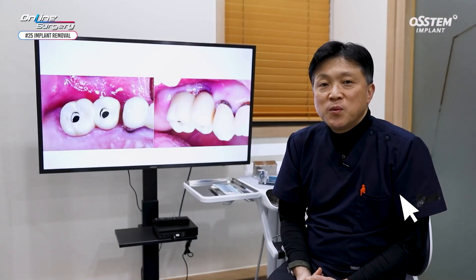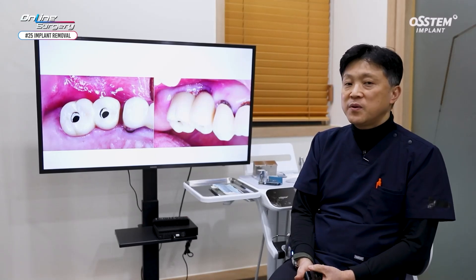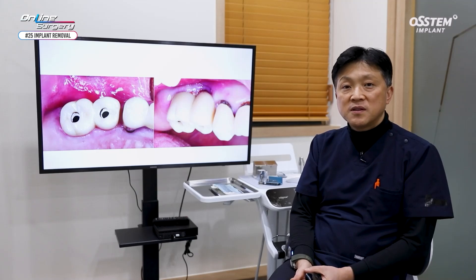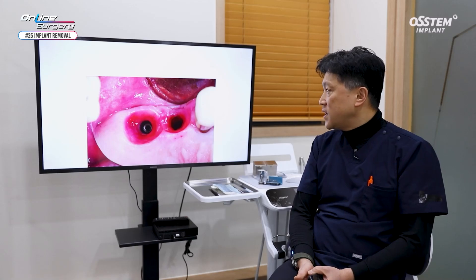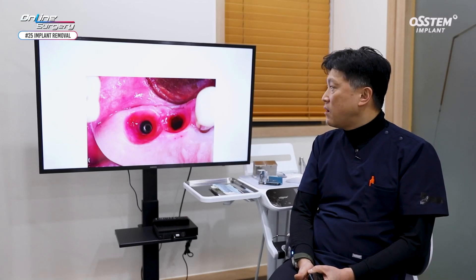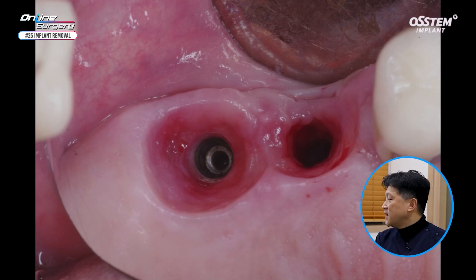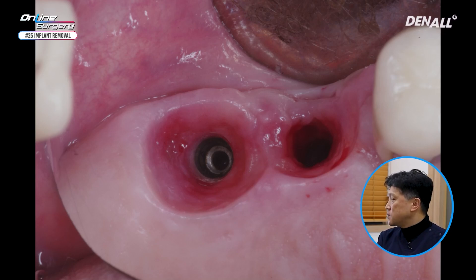Did you enjoy the surgical clip? There was nothing much special. After prosthesis removal, the implant was removed. On the distal implant, a healing abutment was connected, and bone graft was performed where the mesial implant was. After prosthesis removal as shown in number 25, there was quite a significant buccal defect. Also, there was no soft tissue support.